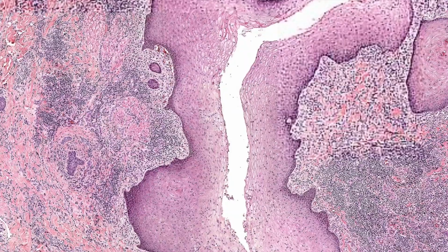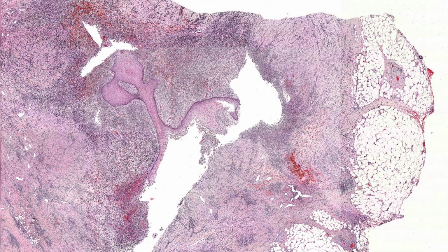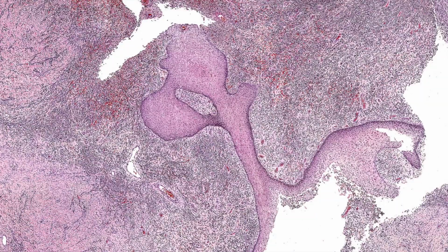It looks like it is involving most of the dermis. And this is even big, even down to the sub-Q, almost like an excision. Yep, all the way down to the fat, and that tract keeps going down deep.